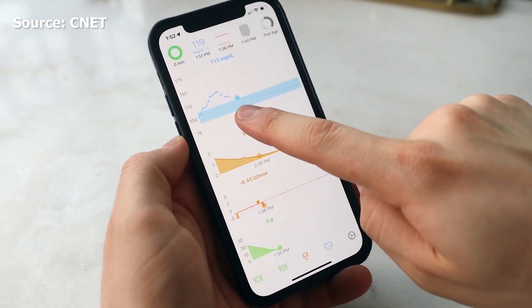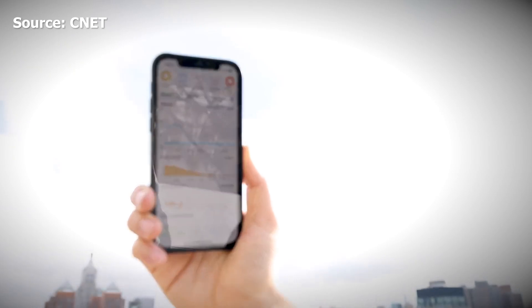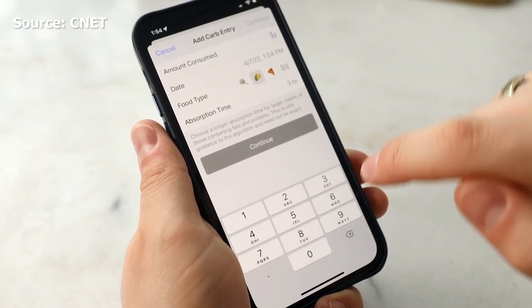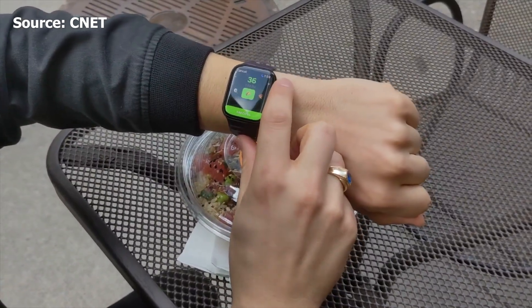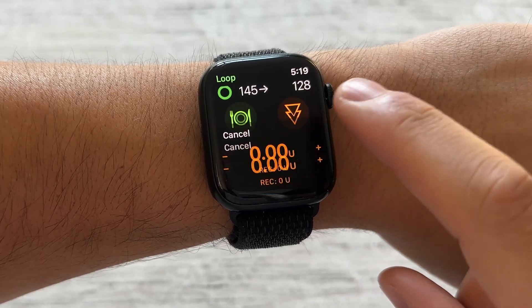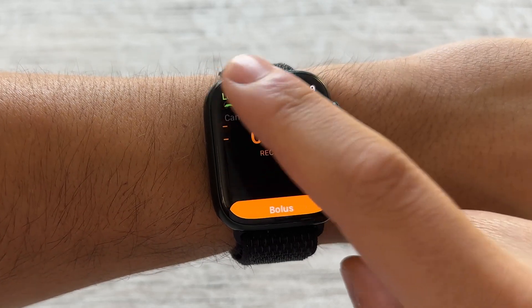Loop is an app on an iPhone that you have to build yourself. It controls all your insulin delivery — you can bolus, you can log meals. It basically is your PDM, meaning you don't need to carry an extra device. You just need the iPhone. There's also a tag-along app on the Apple Watch, which I am a huge fan of. I think everyone who uses Loop should really highly consider getting the Apple Watch just for this feature — being able to control and bolus right from your wrist.